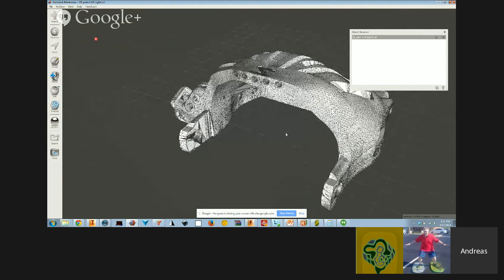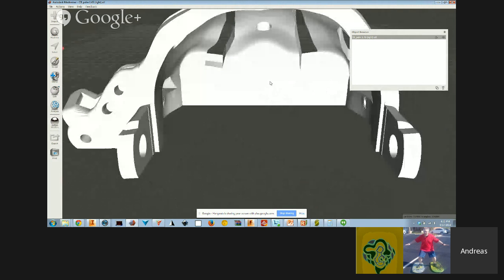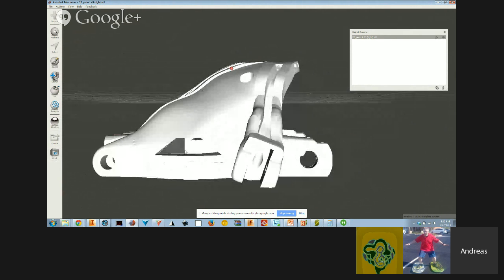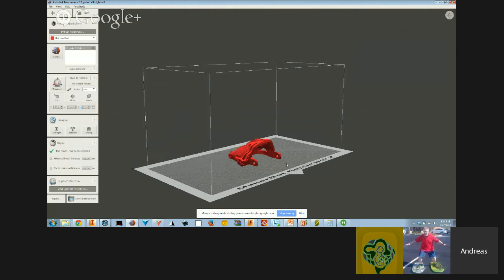Good. What's this? Z. Okay. Super high poly area. Oh, I see. Got it. Okay. So now we want to create some supports for this thing. Typically, what one might do is click this print button, and we can do the supports in that sort of print screen. But what I might recommend is do them in this Meshmixer scene here, because there's actually a couple extra options that are very useful in this side of the tool, as opposed to if I were to click print. Here, I'll just show you what happens when I click print. Now I'm in this sort of print setup, and I can come down and do the add support structure here.